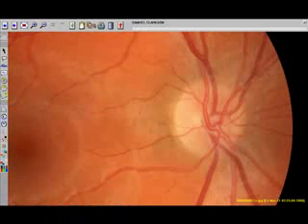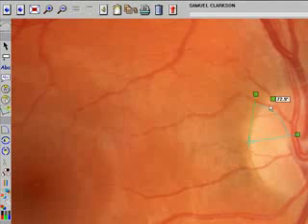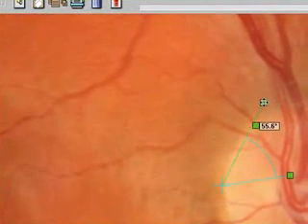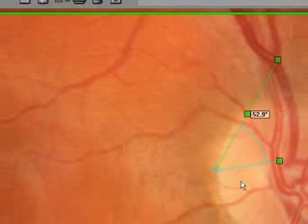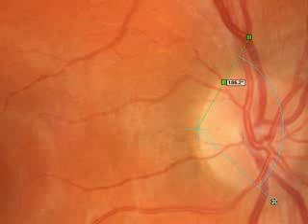To measure an object using the protractor, click on the protractor and click adjacent to the pathology. Spread the squares so that the arc inside of the protractor is coincident with the outside of — in this case — the cup.